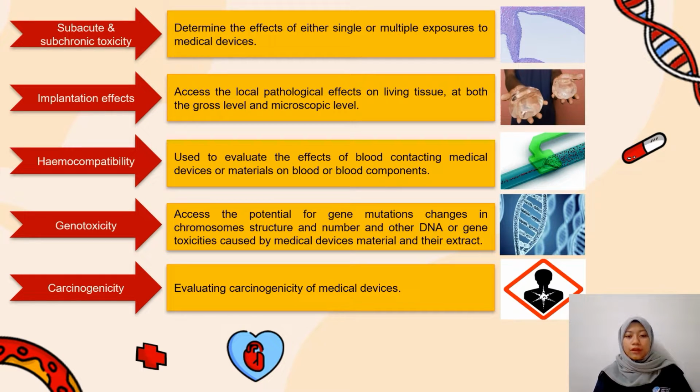It is to determine the effect of either single or multiple exposure to medical devices. Next, we have implantation effects, to assess the local pathological effects on living tissue at both the gross level and microscopic level. And then we have the hemocompatibility test, which is used to evaluate the effects of blood-contacting medical devices or materials on blood or blood components. Next, we have the genotoxicity test, to assess the potential for gene mutation, changes in chromosome structure and number, and other DNA or gene toxicities caused by medical devices, materials, and their extracts. Lastly, we have the carcinogenicity test. It is for evaluating the carcinogenicity of medical devices.